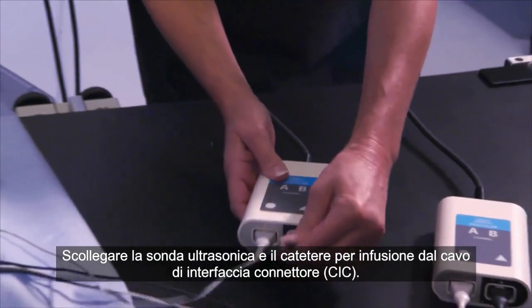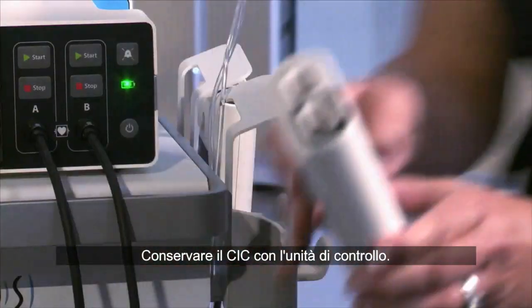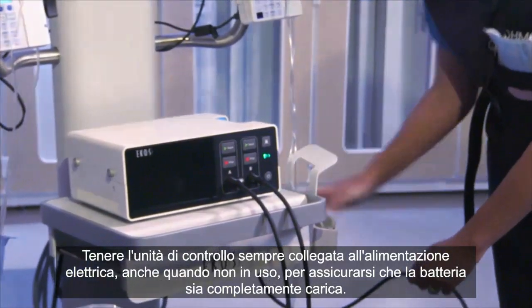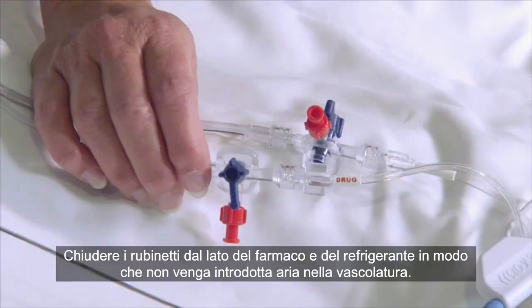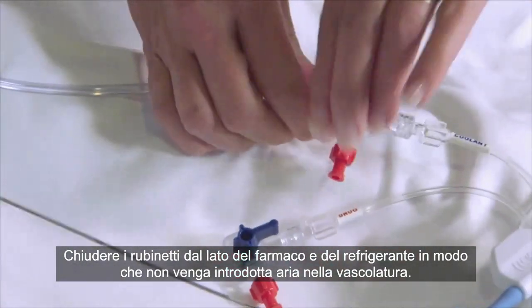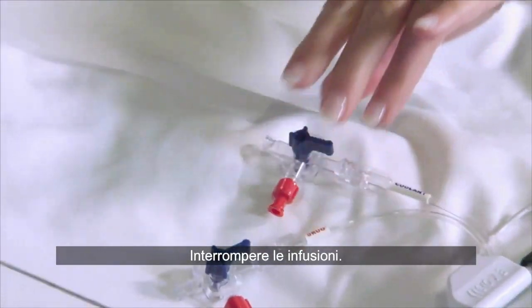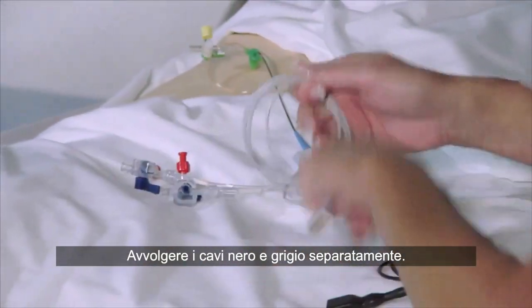Disconnect the ultrasonic core and infusion catheter from the connector interface cable or CIC. Store the CIC with the control unit. Plug in the control unit at all times, including when in storage, to ensure a fully charged battery. Turn stopcocks off to the drug and coolant ports so no air is introduced into the vasculature. Discontinue infusions. Coil the black and gray cables separately.